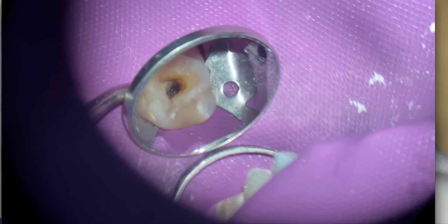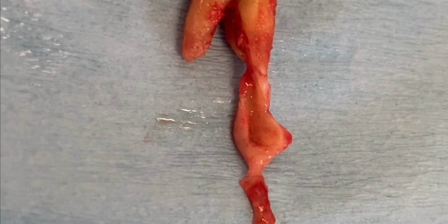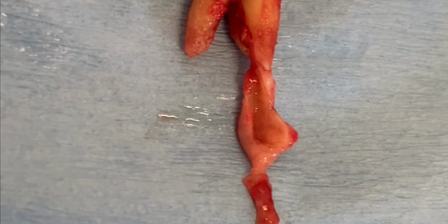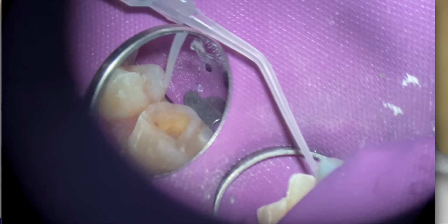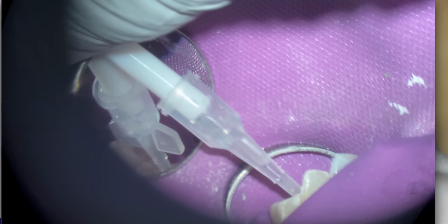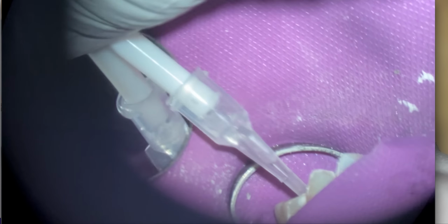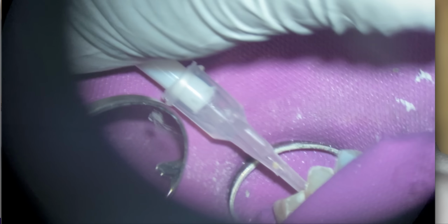Then my mind went back to that cyst. I wondered if this is actually a cyst where perhaps I poked the opening with the file and maybe the paper points. So I'm like, let's take the suction and see if we can get out of this cyst. Okay, well, nothing's coming here. Let's take it a little bit deeper. Nothing. And then I'm going to push it just a little bit further down.